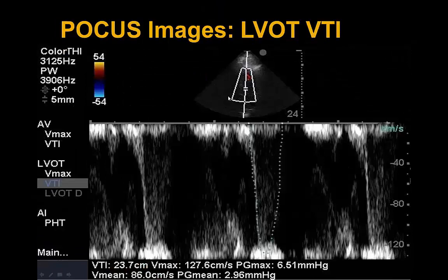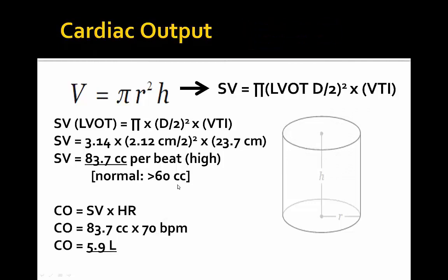For LVOT calculations, we measure an LVOT diameter of 2.12 centimeters. At the level of the LVOT just before the aortic valve, we get a VTI of 23.7 centimeters, which is greater than the normal 18–20, with a max gradient of 6.5 and a mean gradient of 3 mmHg. Plugging into the cardiac output calculation, we get a stroke volume of 84 cc per beat, and a cardiac output of approximately 5.9 liters per minute at a heart rate of 70.